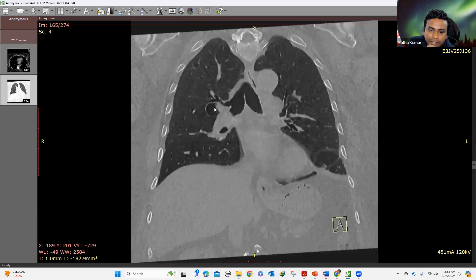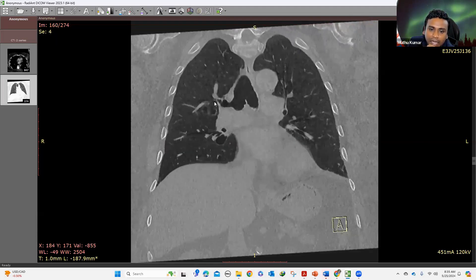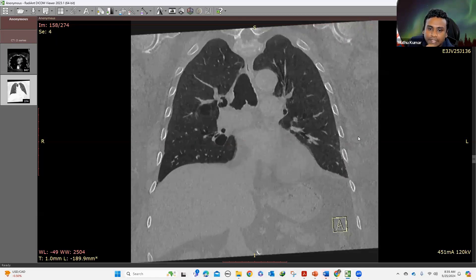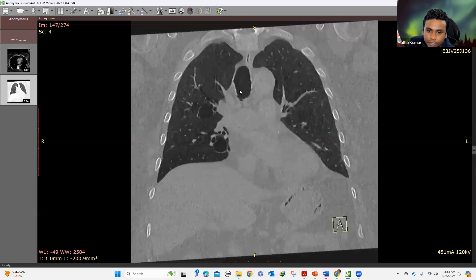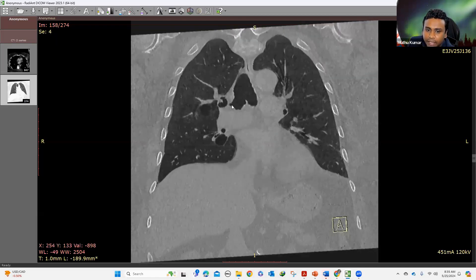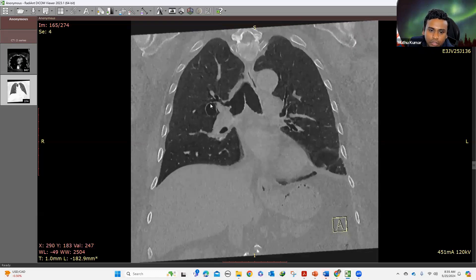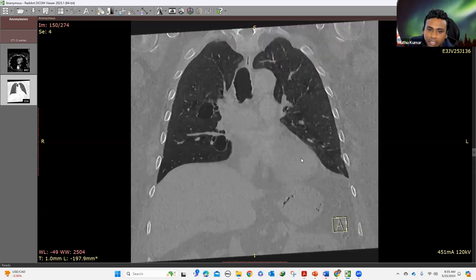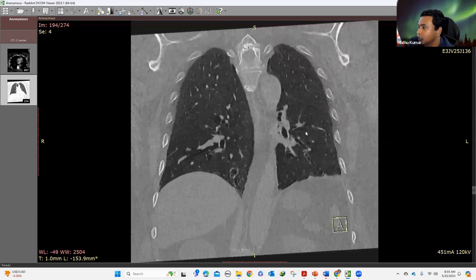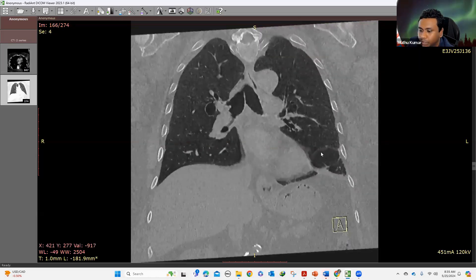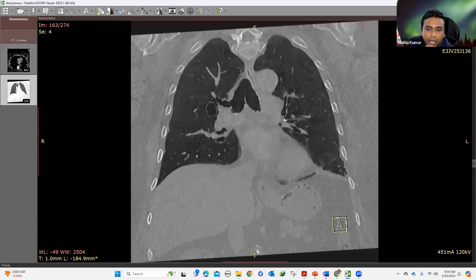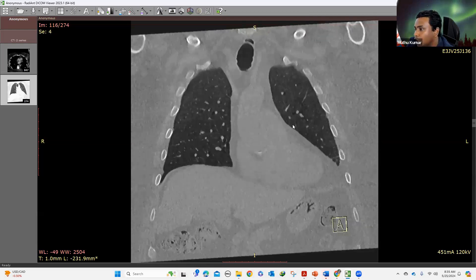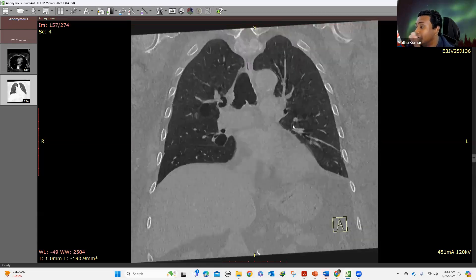always make sure whether there is continuation towards the adjacent bronchi. In this patient, you can see there is tracheal dilatation, bronchial dilatation, and also the bronchi in the segmental and subsegmental region. When you see tracheobronchomegaly extending all the way into the segmental and subsegmental bronchi, I always think of Mounier-Kuhn syndrome. It's a commonly tested pattern in the exam and very uncommonly diagnosed.